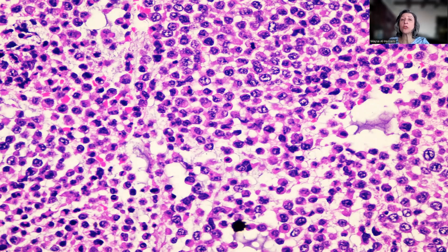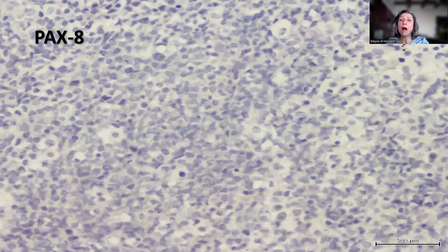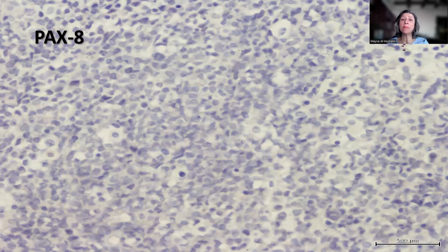Of course, undifferentiated endometrial sarcoma should also come into the differential diagnosis. This is where immunohistochemistry becomes extremely important and how to interpret it. Typically, undifferentiated endometrial carcinoma is negative for PAX-8, and this might cause some confusion or exclusion of carcinoma from the differential diagnosis. But remember, undifferentiated endometrial carcinoma is typically negative for PAX-8.